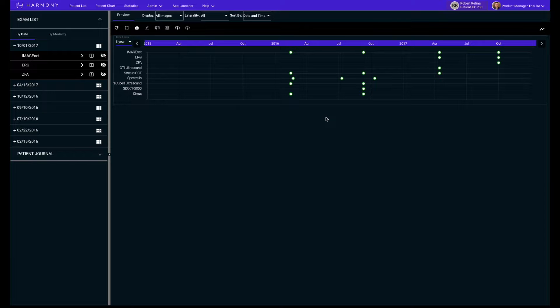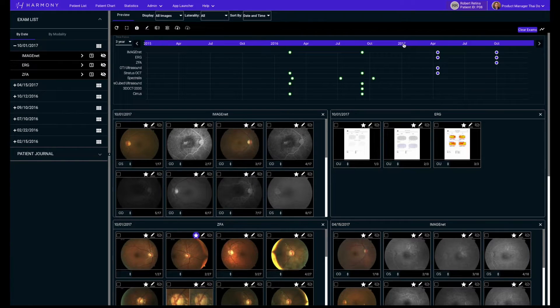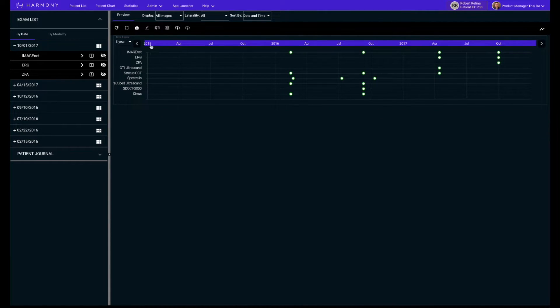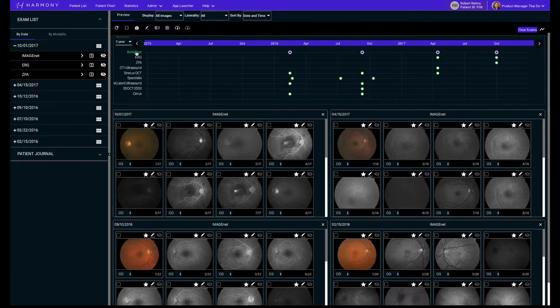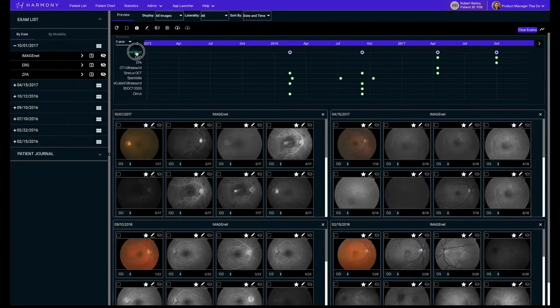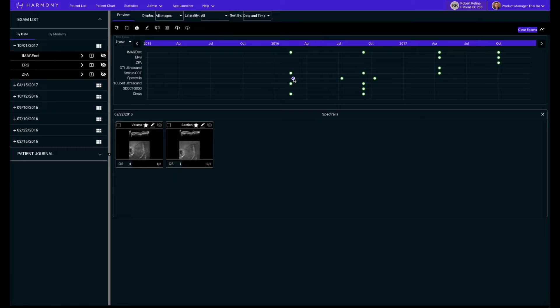There are a few ways to open images directly from the timeline graph. Clicking on the year at the top opens all exams for that year. Clicking on the device on the left displays all images for that device. You can also individually select the exams by clicking on the dots.